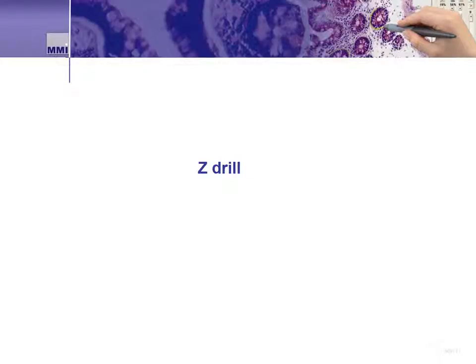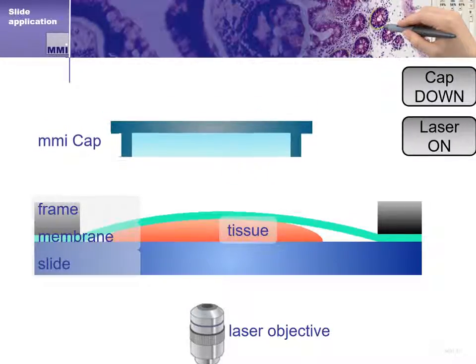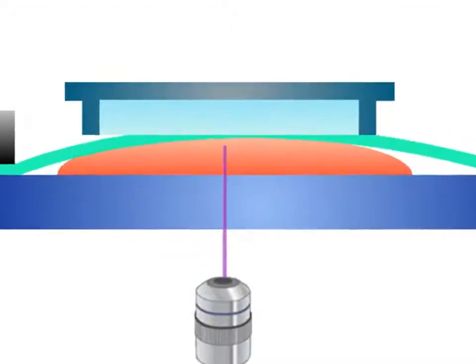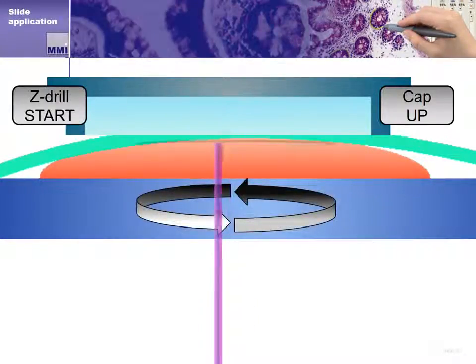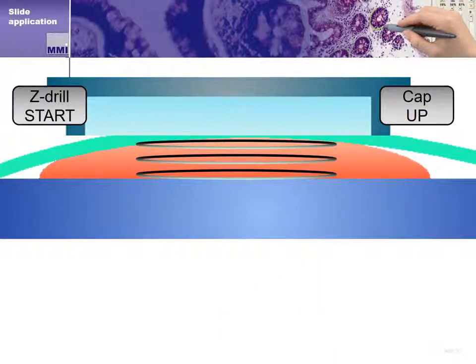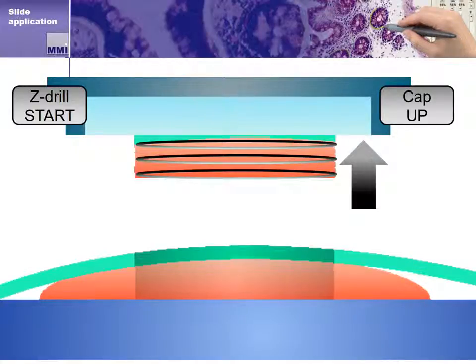Now we'll discuss another advanced application that allows end users to neatly and cleanly cut very thick samples — it is called the z-drill method. When working with sections that are very thick, perhaps 100 microns or more, the MMI CellCut's z-drill function becomes useful. The system identifies tissue the same way we've discussed, but we now identify the thickness of the tissue and set our z-drill to cut the entire thickness of the selected region. It does this with multiple precise cuts in the same location. When all the cuts are completed, the cap system lifts the thick tissue section off the membrane slide in the same way described earlier.